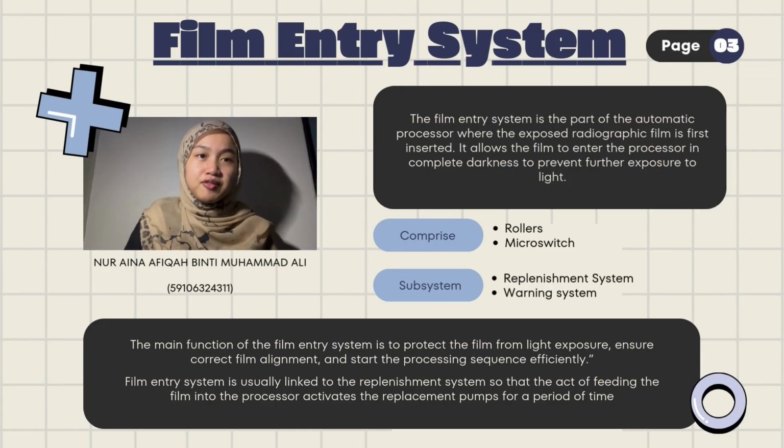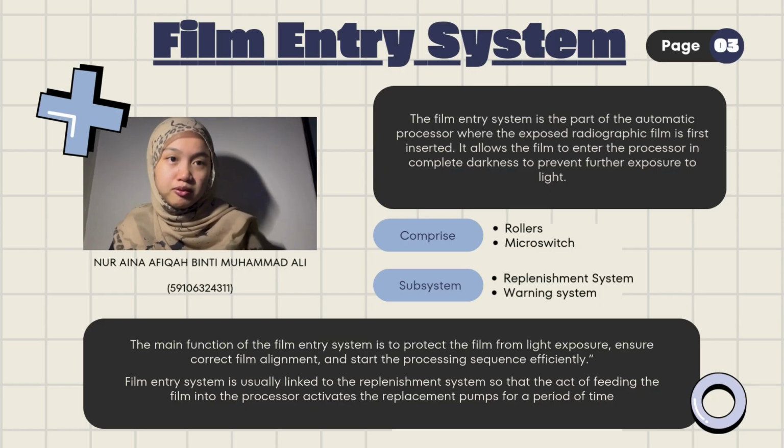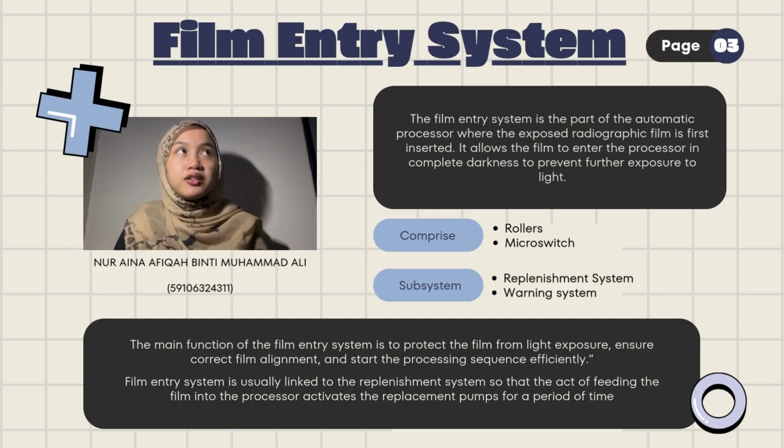The film entry system is the part of the automatic processing system where the exposed radiograph film is first inserted. It allows the film to enter the processor in complete darkness to prevent further exposure to light. It comprises rollers and a microswitch. There are two subsystems, which are the replenishment system and the warning system.